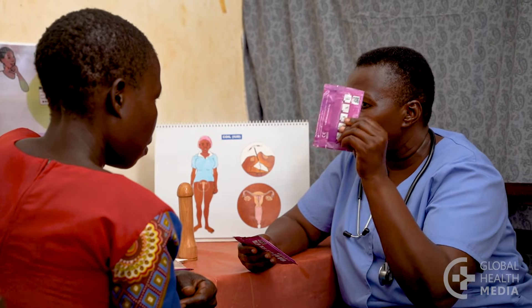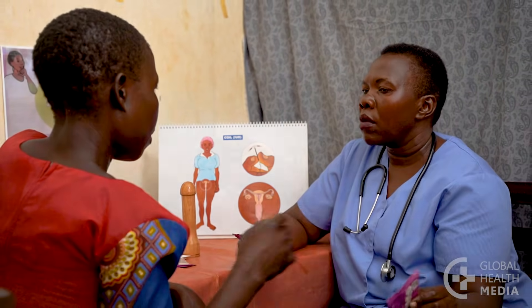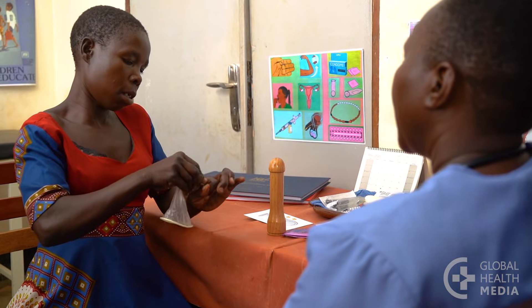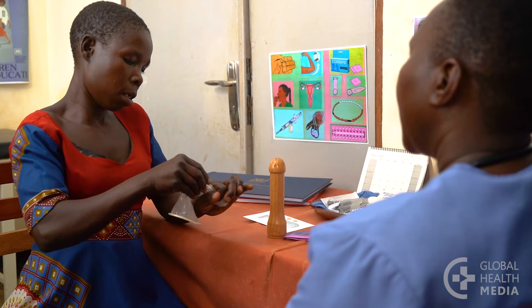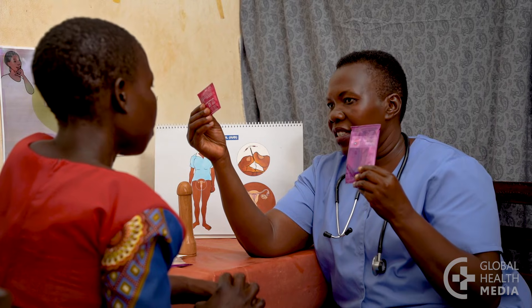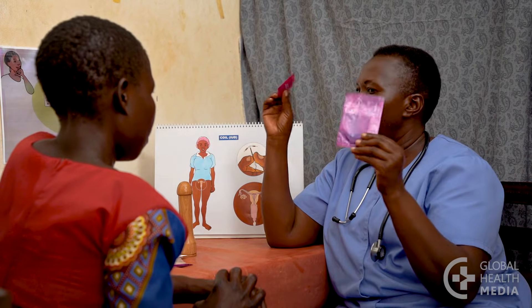Remind her to only use it once. Have the woman try handling the condom and practice inserting and removing it. Caution her not to use a male and female condom together — they'll be more likely to tear.